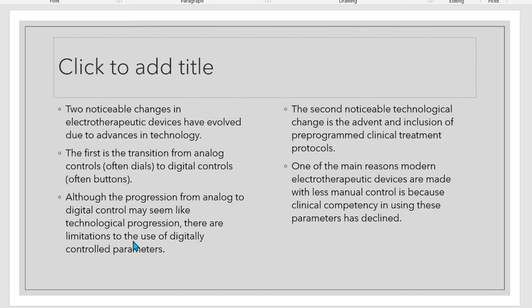So that's why there's poor clinical decision making, and at the same time poor clinical competency in how to differentiate between using ES or TENS for the patient, whether to use this modality to re-educate or stimulate the muscle, or to address pain.